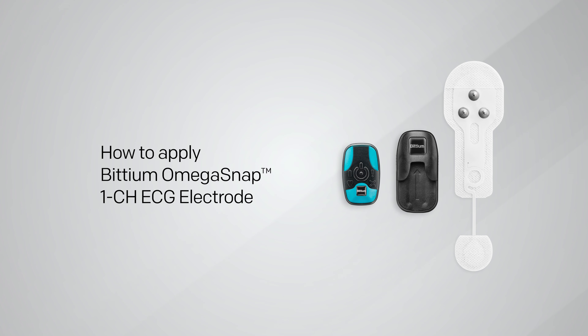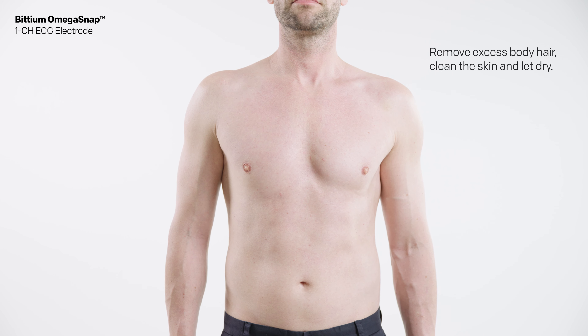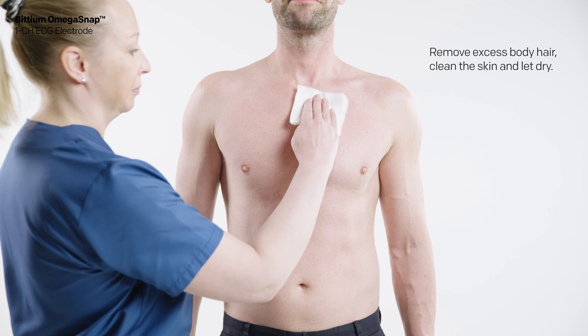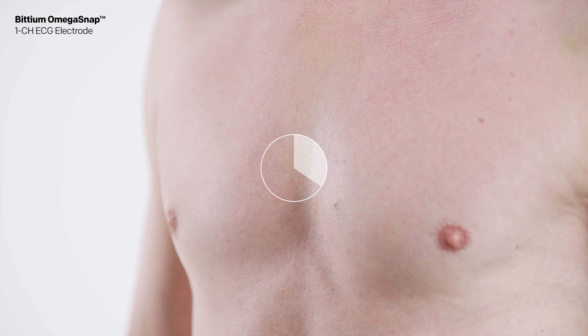How to apply BITTIUM Omega SNAP one-channel ECG electrode. If needed, remove excess body hair using a razor or an electric shaver. Clean the skin according to the instructions given by your clinic or the person responsible for treatment. The skin should be clean and dry when attaching the electrode.